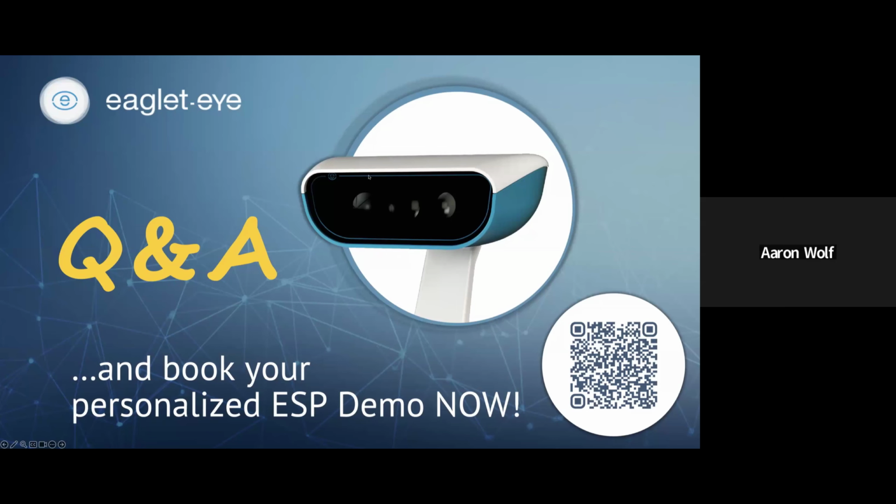With the Eaglet, it doesn't really matter, because there's tear film no matter the elevation change, how extreme or mild. It makes no difference. There's going to be some amount of tears over top of that. And so the device can basically project those grids onto that tear film, and those really more complicated cases it just kind of excels in.